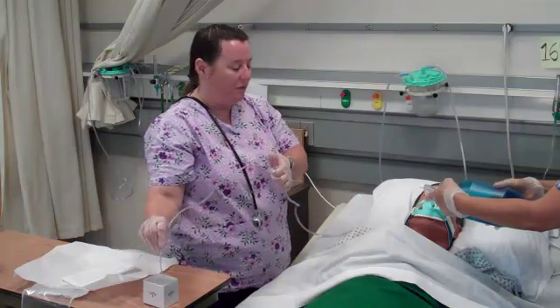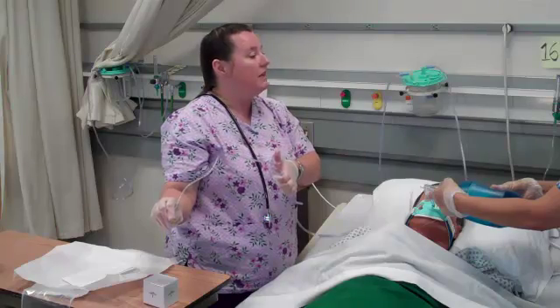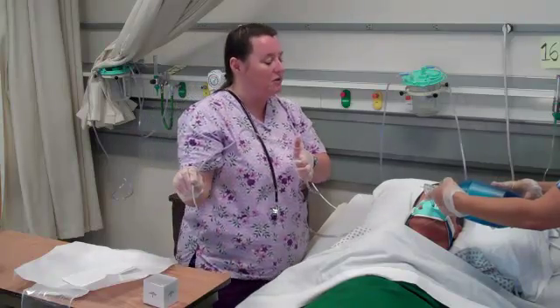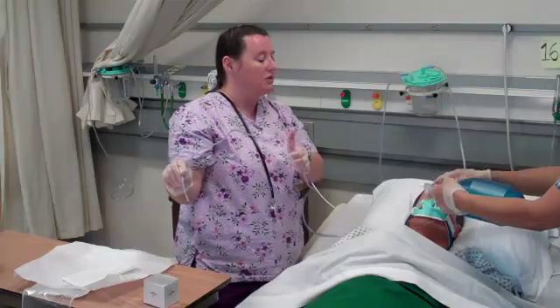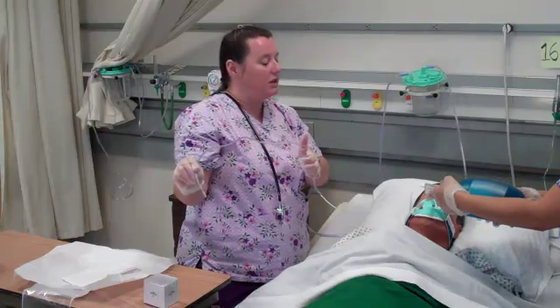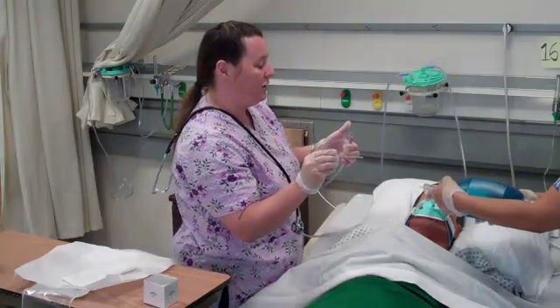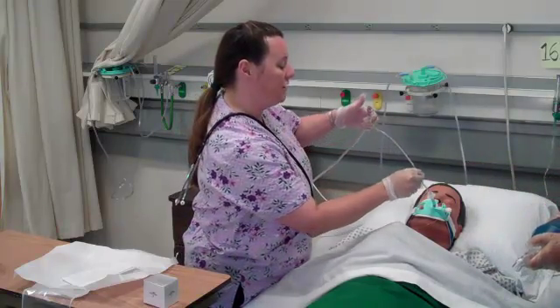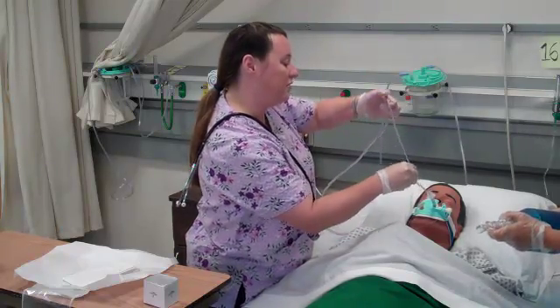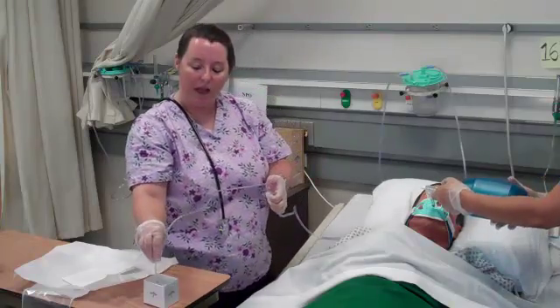I'm going to reassess my patient and check the monitor to see if oxygen saturation has come up, whether heart rate has returned to baseline, and that no arrhythmias are present. If I've stimulated an arrhythmia, I would stop the procedure. The O2 sat has come up slightly but hasn't reached his normal saturation yet, so his condition warrants a second pass. The patient is again removed from the oxygen source. I go down again with sterile technique, hit resistance, patient coughs — I pull up a centimeter and apply intermittent suction, twisting and turning as I come out. I'll clear the tubing.